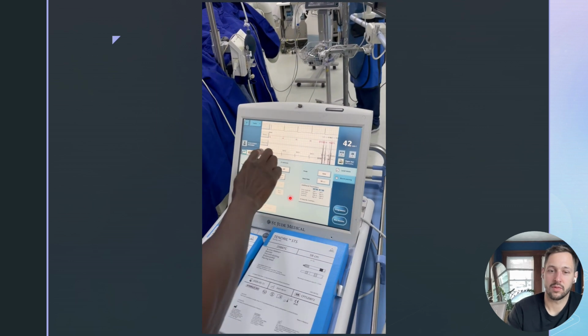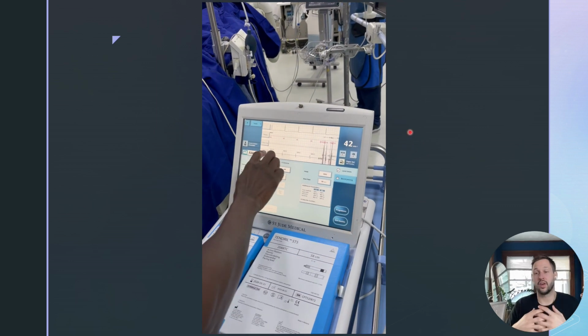All right, so what are our big takeaways here? He initially started and saw his injury current. Injury current looks good, nice, wide, good amplitude, but once again, we're looking at width. Next, he looked at his impedance. What is the impedance? Is it within an acceptable value?